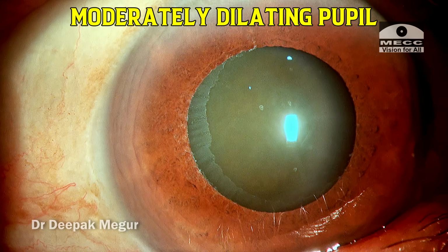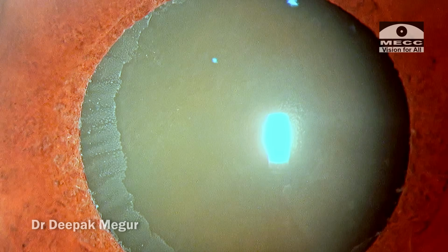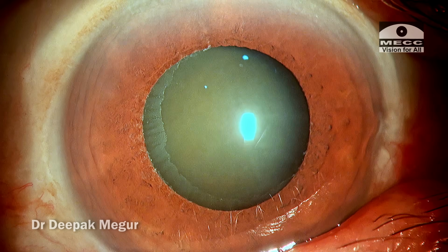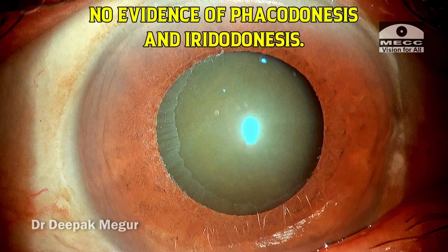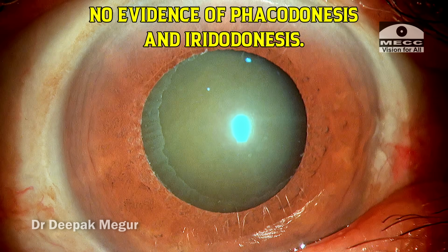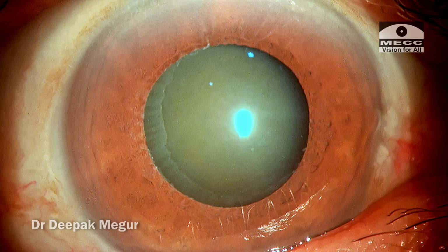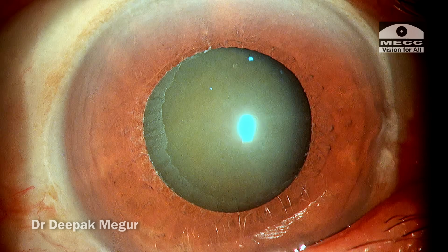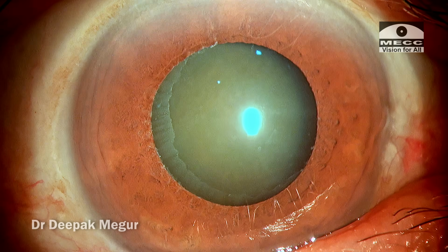So the pupil is moderately dilating. We can see this pseudoexfoliation material on the pupillary margin, on the anterior lens capsule. The nucleus seems to be fairly dense, and at this stage there is no gross evidence of phacodonesis. So the zonular health I'll be able to assess only when I touch the anterior capsule later on. So I'll take a call on the IOL placement only after the intraoperative assessment of the zonules.